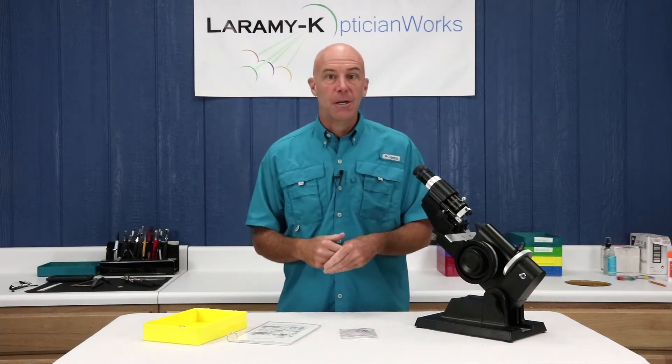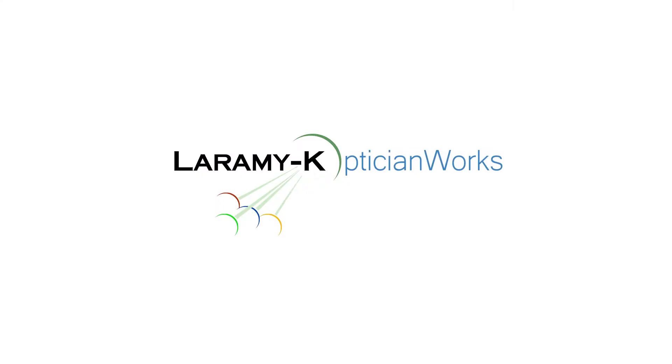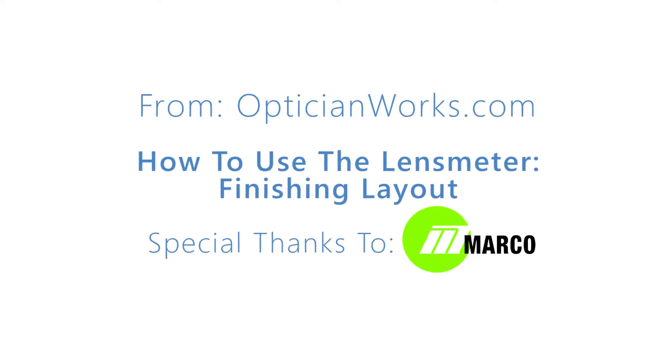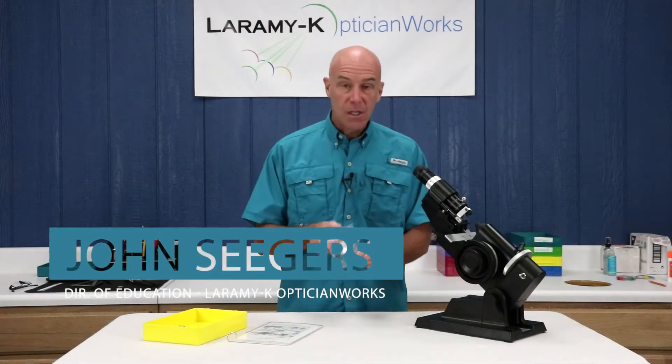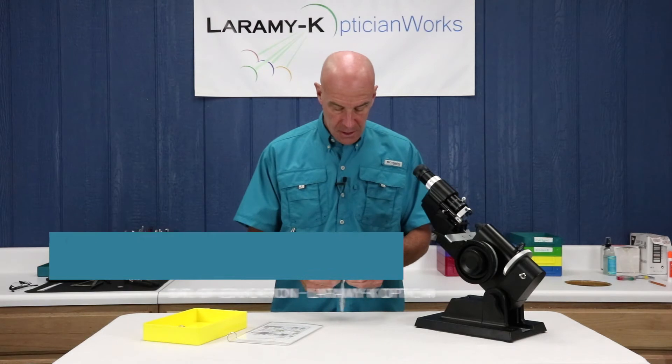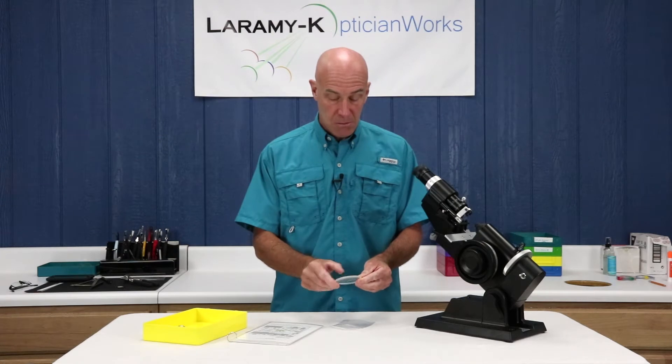Hello and welcome back to our ongoing series. Let's learn how to use the lens meter. Today we are going to take an ordinary single vision lens and learn how to use the lens meter to do finishing layout work. Today is kit number seven — find your number seven envelope. Let's take that lens out of the bag and make sure that we've got that etched number seven mark on there.